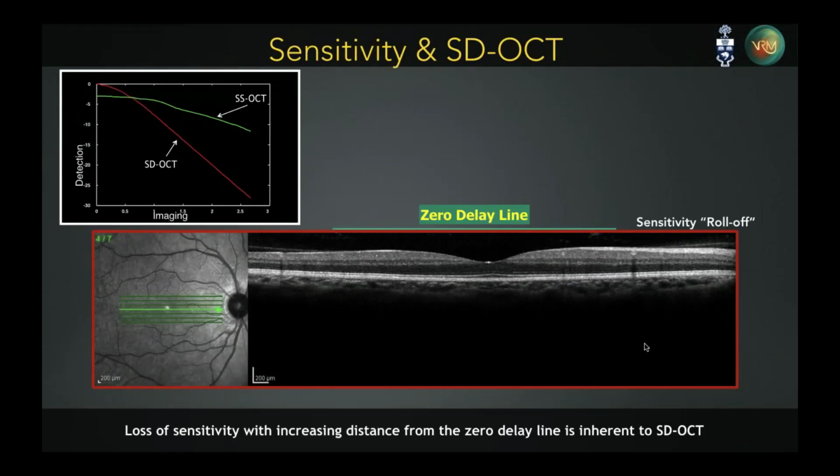Here is one of the gold standard OCT devices that many of us have used in the past, the Heidelberg Spectralis, probably one of the better spectral domain devices that's out there that's not a Topcon unit, of course.